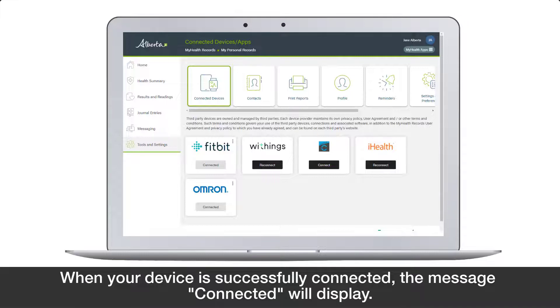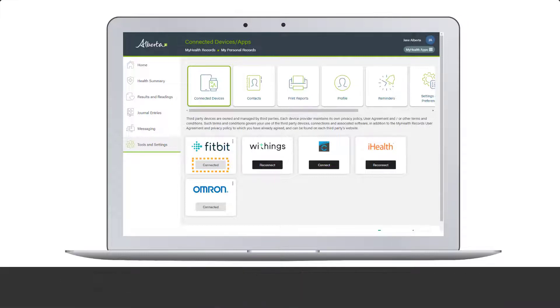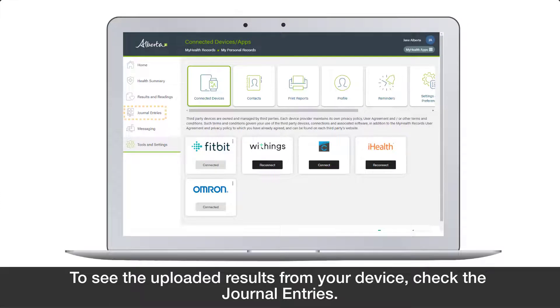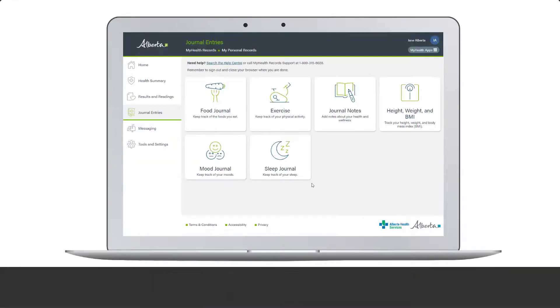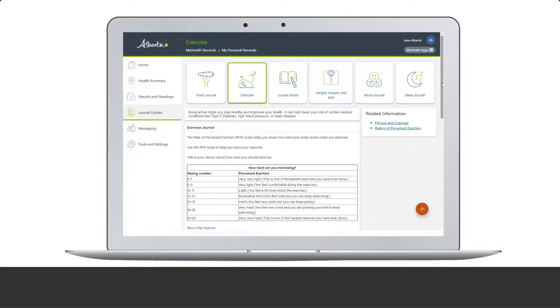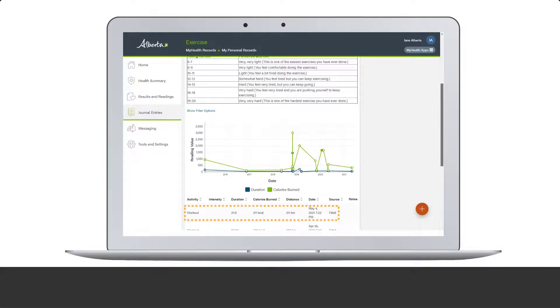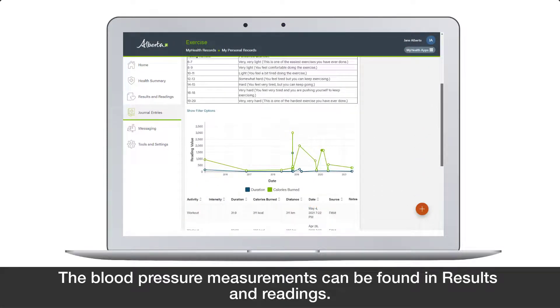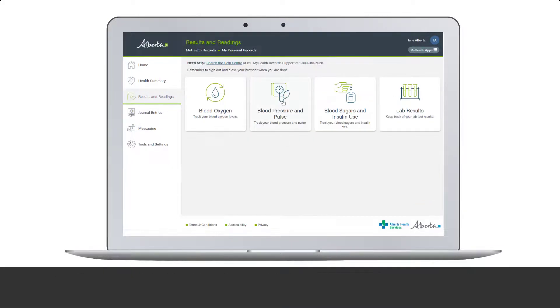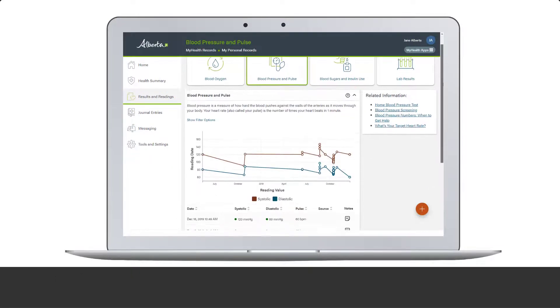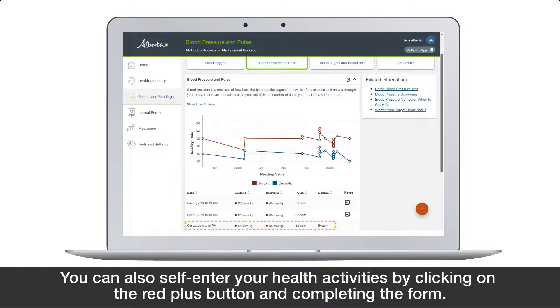This will connect and share your information from your connected device. When your device is successfully connected, the message 'Connected' will display. To see the uploaded results from your device, check the journal entries. Blood pressure measurements can be found in Results and Readings.